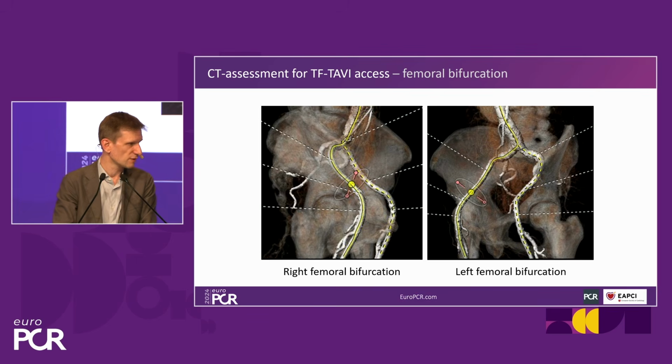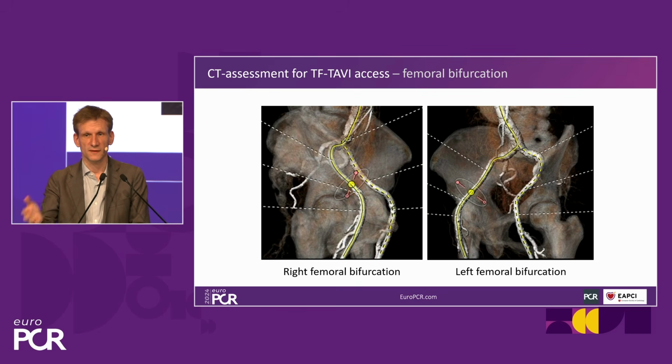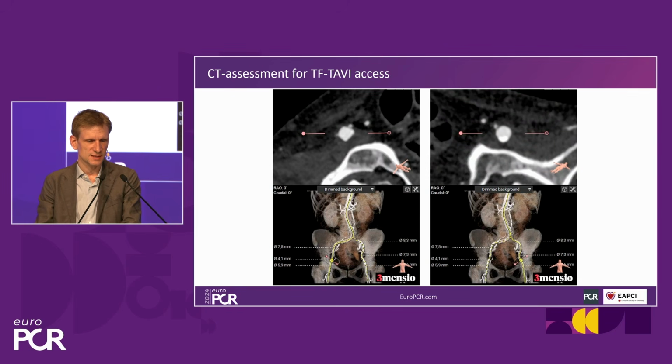On top of that, I take more information in the cath lab because I am prepared, or at least the fellows are prepared, to write down also the size of the balloon and stent if I would run into a problem. So this is not something we go to inspect when we have the catastrophe and the problem in the lab. No, this information we take on a paper, we make a note. Well, okay, if we need a balloon, we're going to use a 7 mm balloon, we're going to use a 9 mm covered stent. That is ready. We have that information with us, and very often this material is already lying ready on the site. We don't unpack it, of course, but in case, which is luckily rare, we have it. So then I think for the access, that's enough about CT.